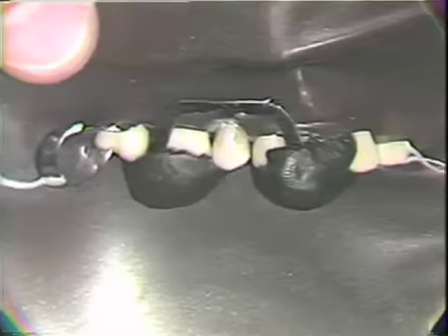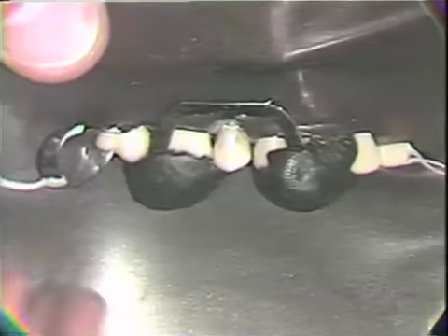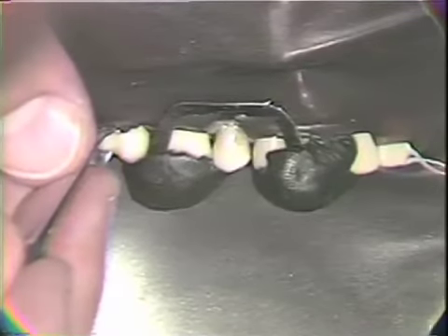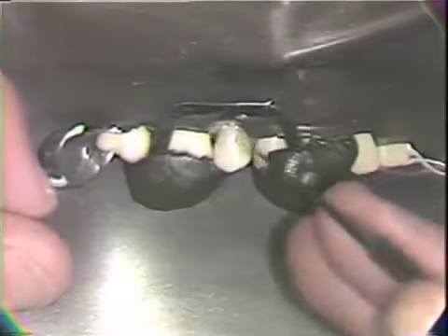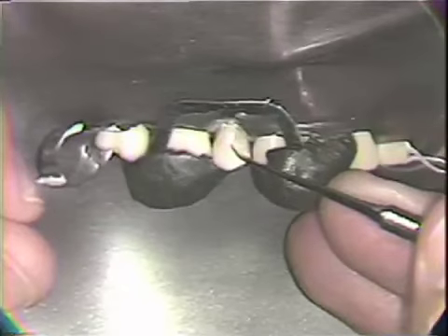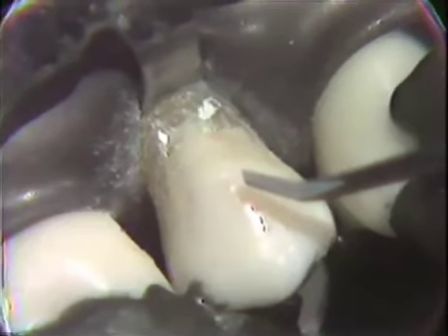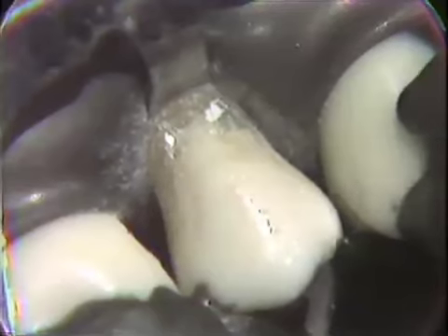Now we'll move back to the 6.5, 2.5, 9 again and consider the retentive form. Retention is going to be placed, the major position will be cervical, the minor position will be in the occlusal area. With the 6.5, 2.5, 9, it'll be placed, the bevel of the cutting edge really against the axial wall. The cutting edge itself is placed in, extending that axial wall into a cervical position with a lateral scraping motion.